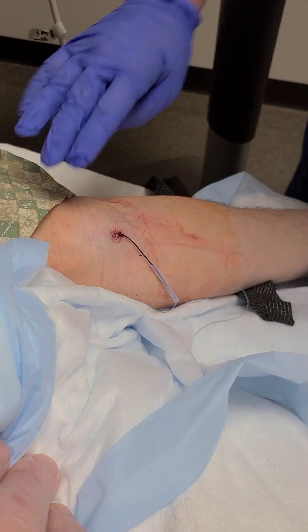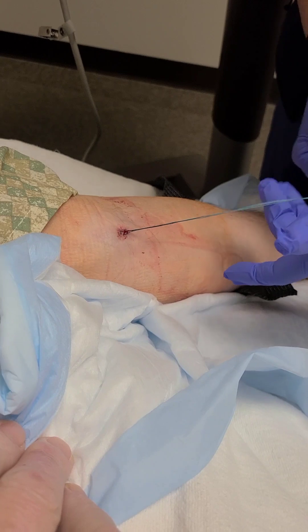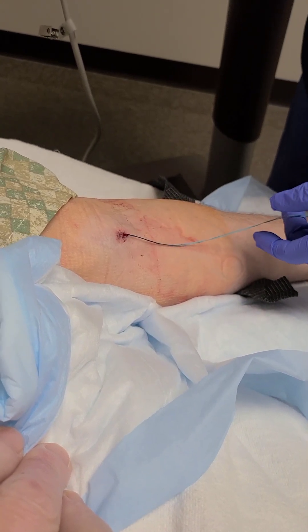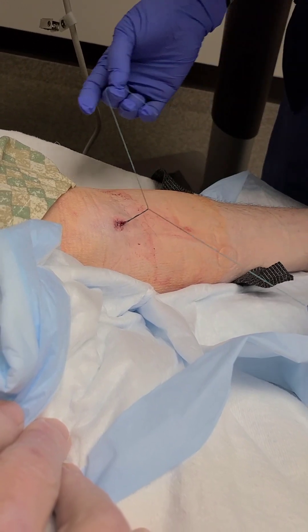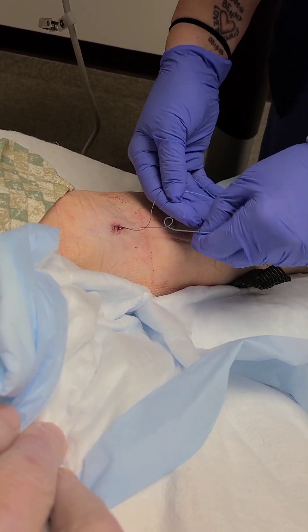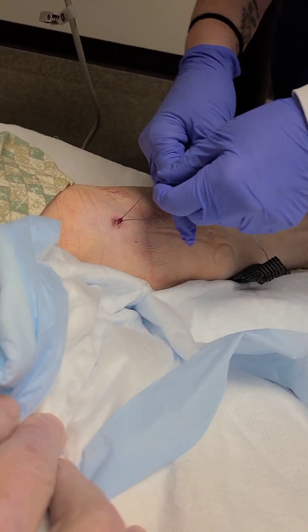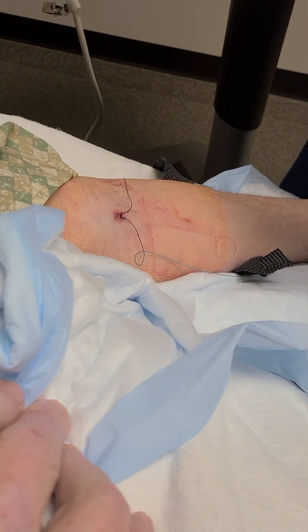Is it tender in there at all? No. All right, so it's doing good. Then I'll take that off. Then you'll have the two sutures here — you're going to kind of try to separate them out. The two ends. Now, important: you only want to cut one of the ends.